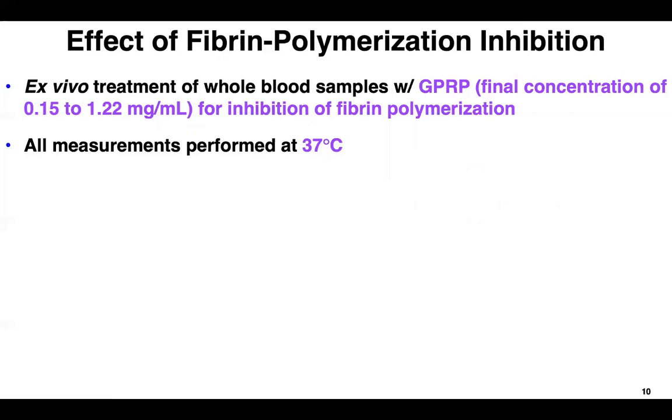The samples were incubated at 37 degrees Celsius for 15 minutes before adding the calcium chloride. The ClotChip sensors were filled with 9 microliter of the mixture and kept in a thermostatic chamber at 37 degrees Celsius during the experiment.